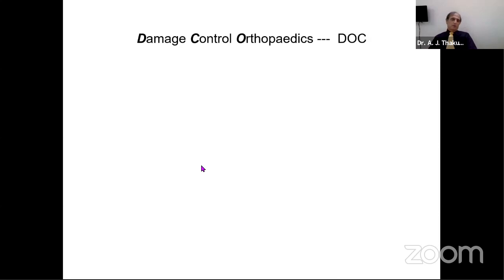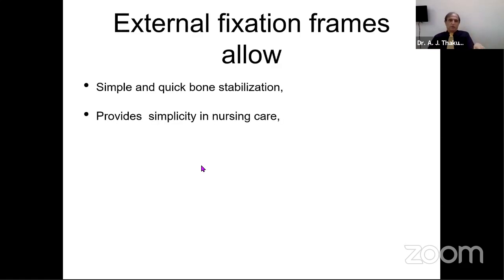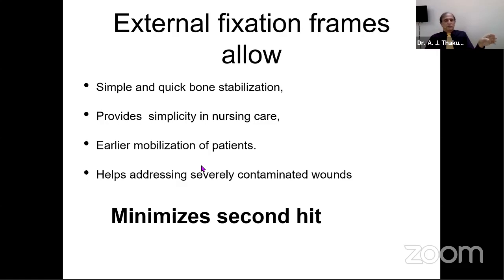Now, damage control orthopedics is the current concept, which means the patient is to be tided over till he's hemodynamically stable. So, nothing like external fixation. It is simple and quick to apply, provides simplicity in nursing care, early mobilization of the patient, helps address severely contaminated wounds, and minimizes the second hit. If you take him to the operation theater and do an internal fixation, there will be more assault on his body. With external fixation, minimum surgical trauma, maximum benefit of stabilization, so the patient gets another chance at everything else.